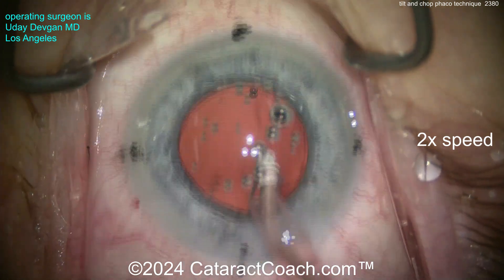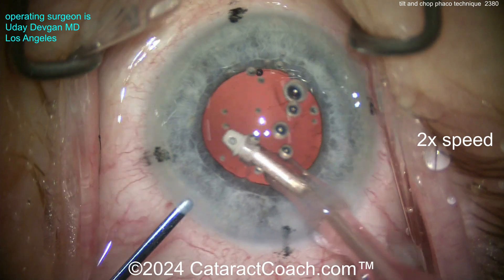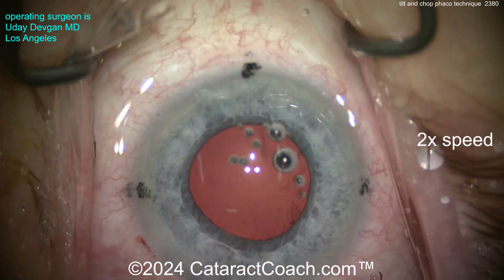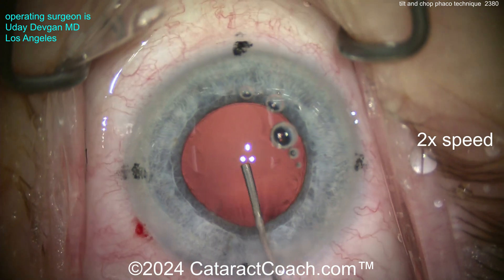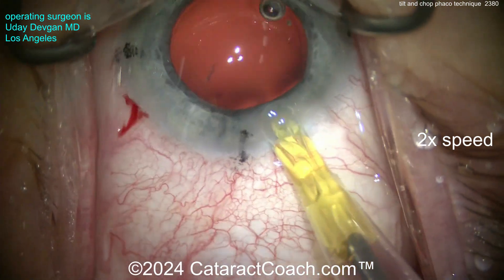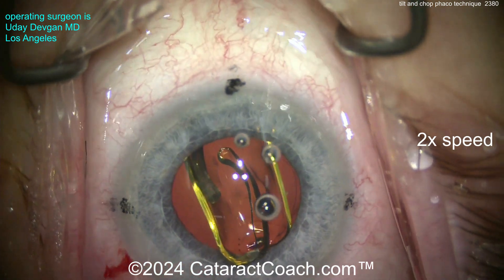I just want to show you the end of the case to show you that beautiful capsule rhexis. You're not going to damage the capsule rhexis if you have at least a five millimeter diameter. If you have a four millimeter capsule rhexis and significant nuclear density, you won't be able to get the nucleus to prolapse out of the bag — tilt and chop won't work there.